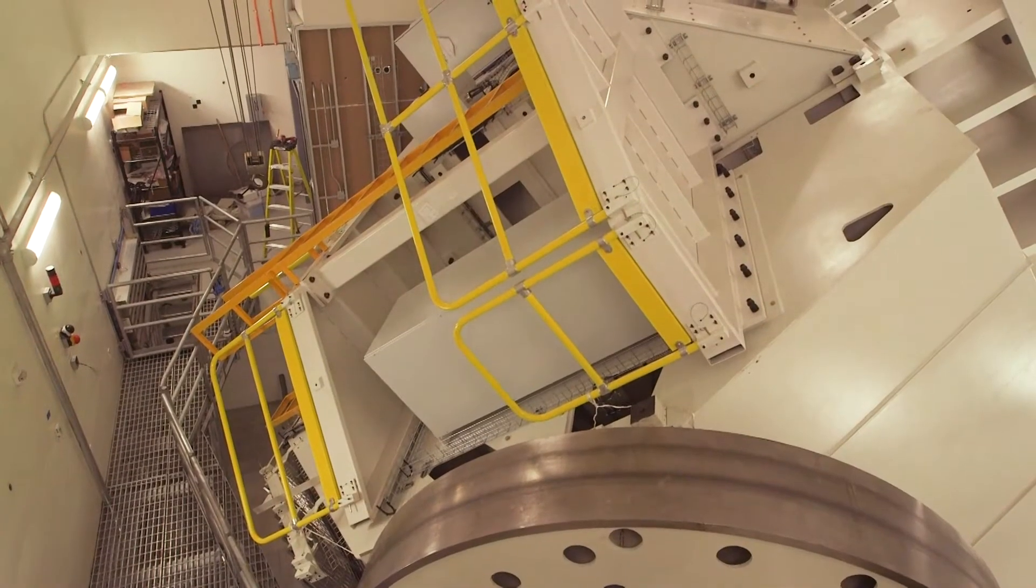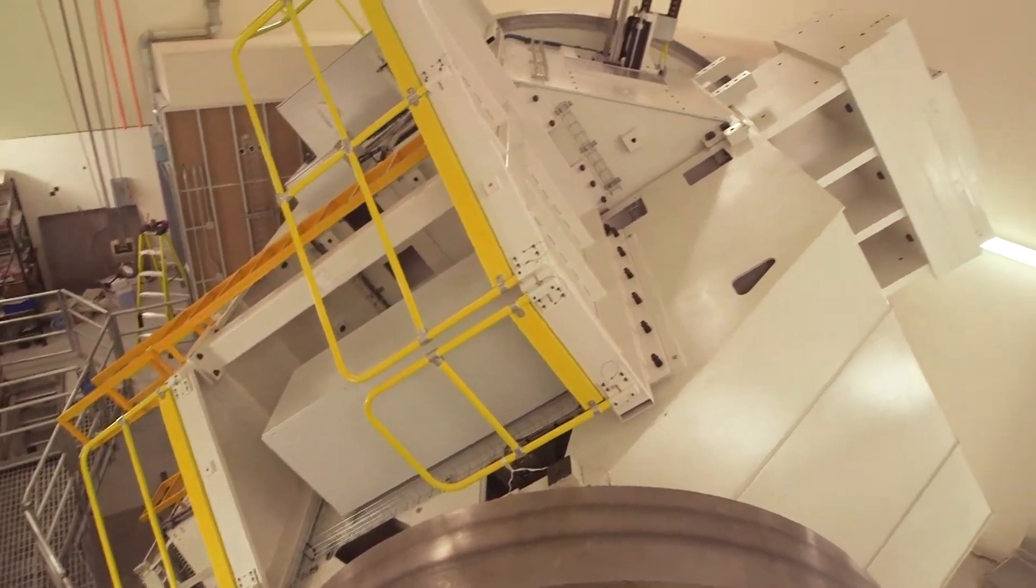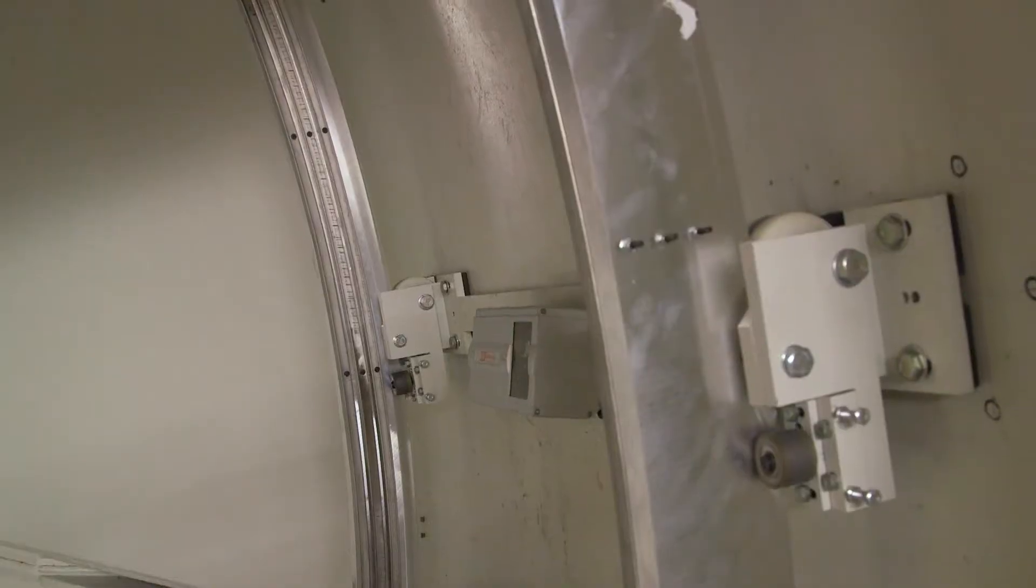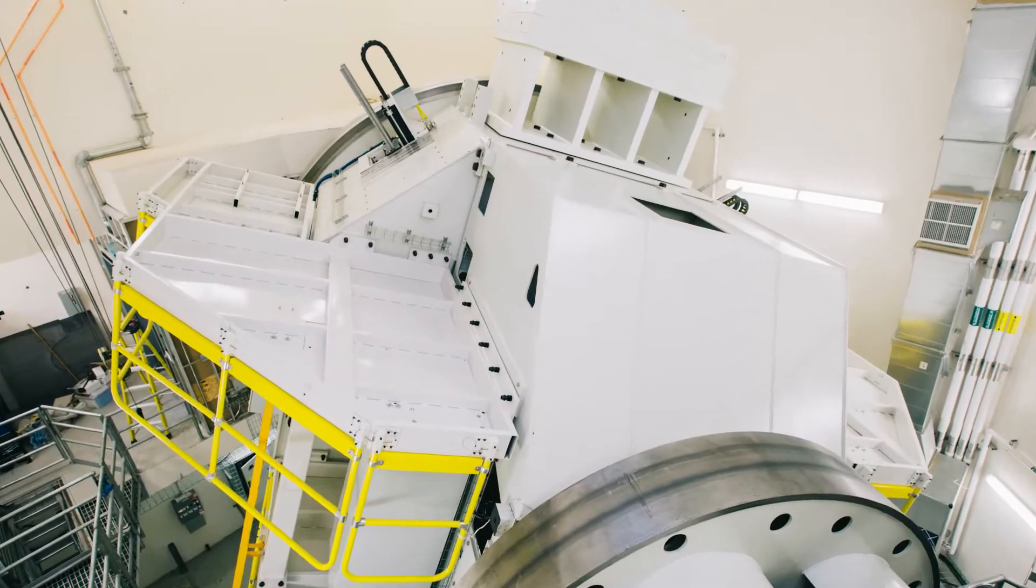Each patient treatment room is structured around this massive steel structure called a gantry. It weighs 240 tons and can rotate around the patient so that the proton beam can be angled with great accuracy directly to the tumor site.